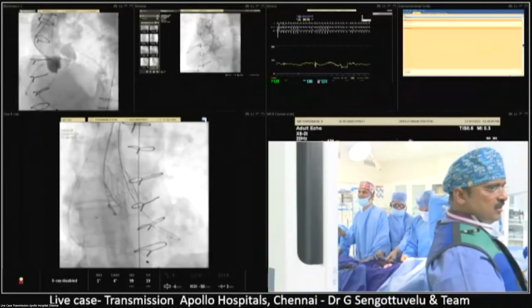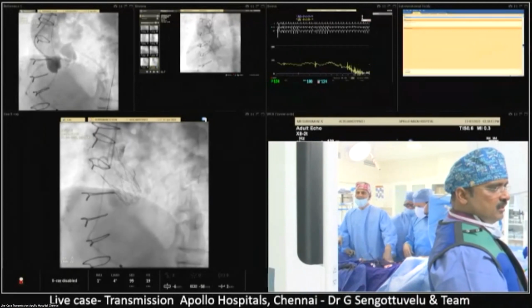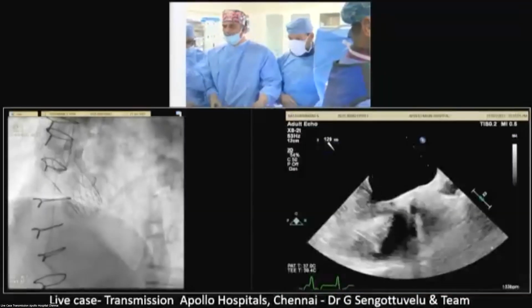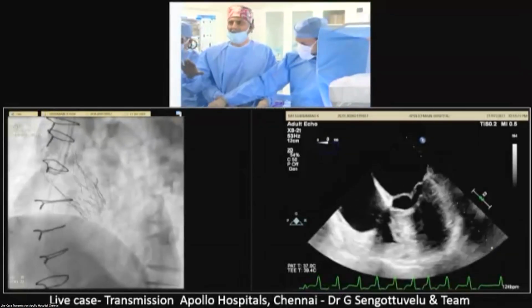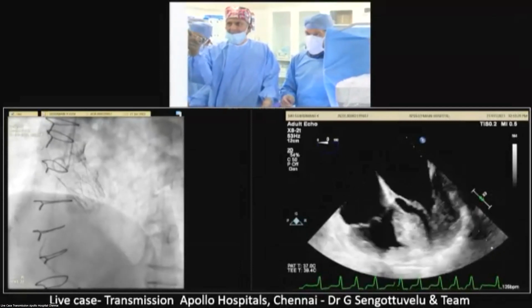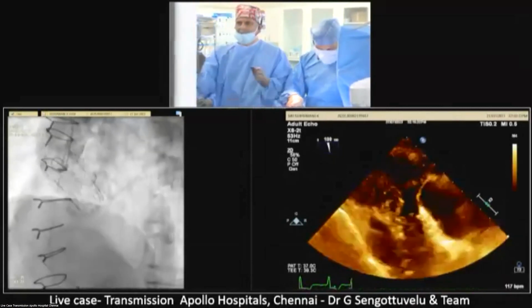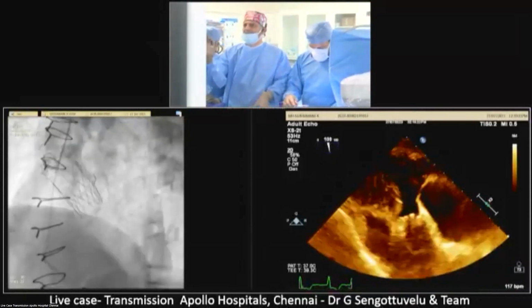We're back now. Can you hear us? Yeah, Sushil, thank you for coming back. Can you see the fluoroscopy now? Yes, we can see. If you look at this, after we were observing for almost nearly 10 minutes, you see this upper crown clearly now. It's just below the coronary, and you see the narrow sinotubular junction. If you look at both sides, the upper crown is just below the STJ.